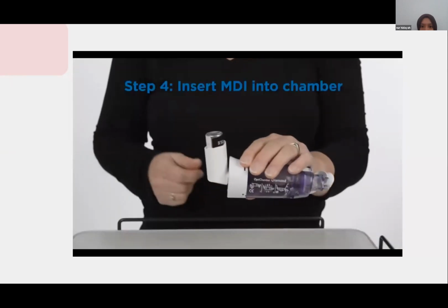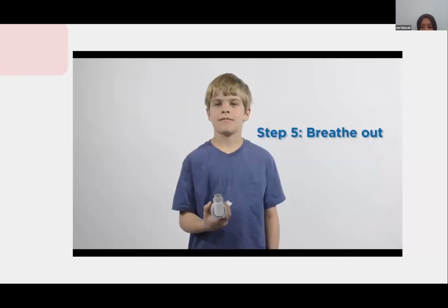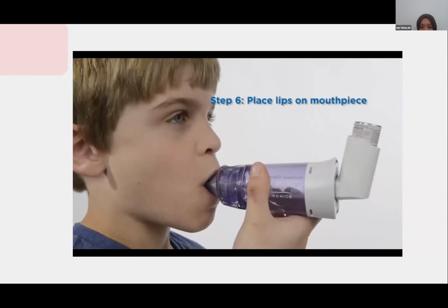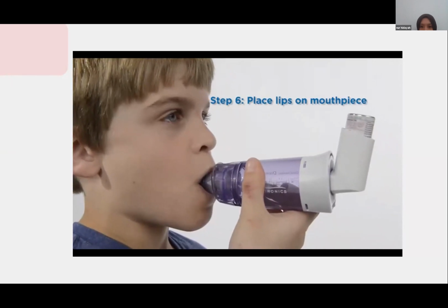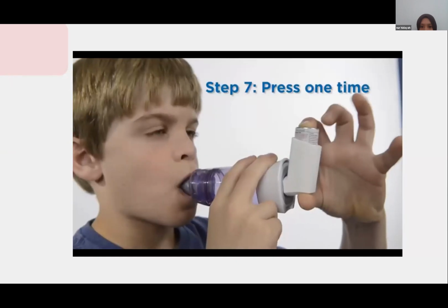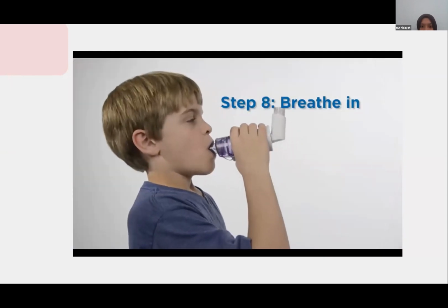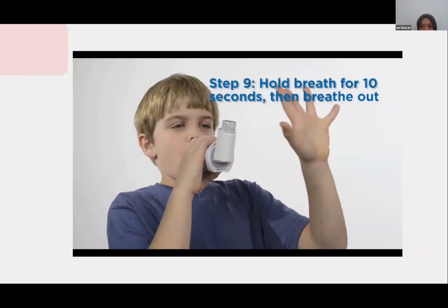Insert the opening of the MDI into the rubber-sealed end of the spacer. Stand or sit up straight. Breathe out completely. Put the mouthpiece between your teeth and make a tight seal with your lips. Make sure your teeth and tongue are not blocking the mouthpiece. Press the top of the MDI so it sprays into the chamber. After spraying the MDI into the valved holding chamber, breathe in slowly and deeply. Hold your breath for 10 seconds, then breathe out normally.